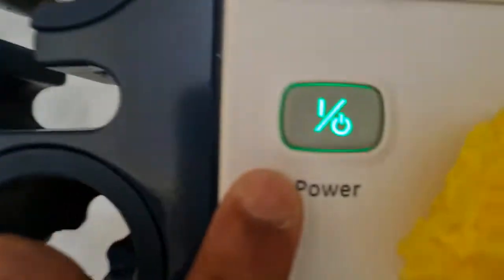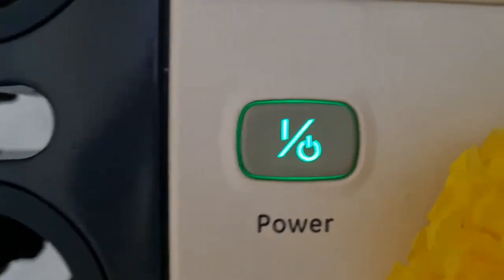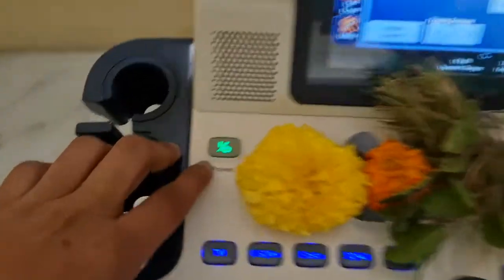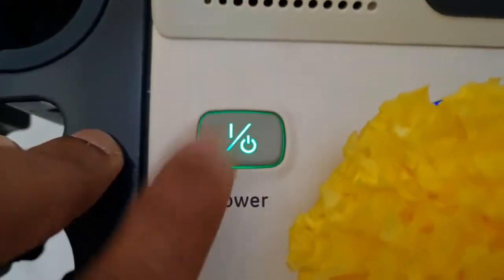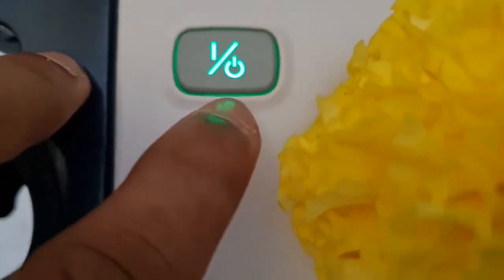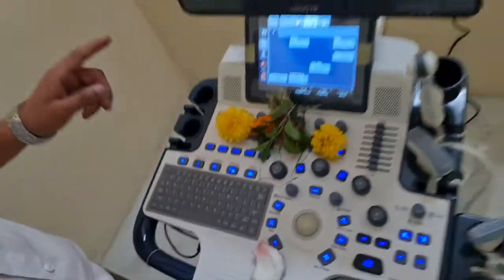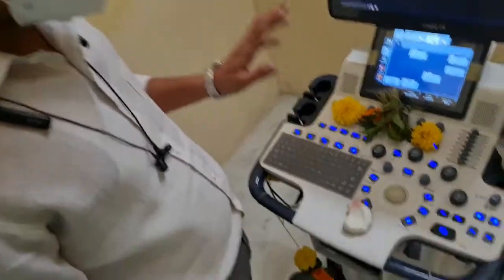If you want to switch on the machine, first plug the wire in. First plug in the power point. Okay. Then it will glow in blue color. After switching it on, it will turn green. Okay. And suppose you want to change the probe, we have two ways.